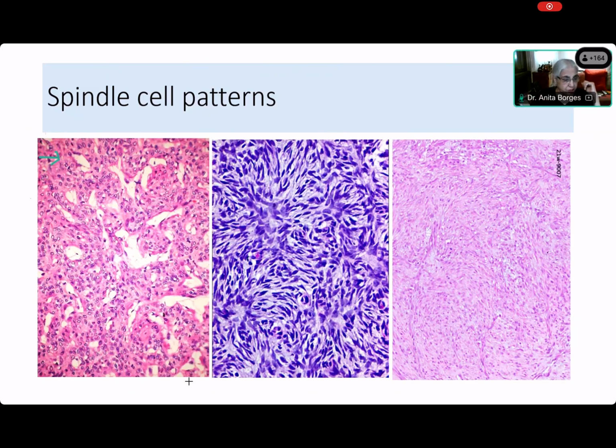No, Kedar is having difficulty. Shashank, what is this pattern that you see in this left-hand side thing? There are people in the chat box answering. All right, Chandana. Yeah, Chandana. No? Okay. Diksha. Ma'am, hemangiopericytomatous pattern. Yes, and this is not correct. Diksha, is it the spindle cell that's forming this pattern or what is forming the pattern? Ma'am, vessels are branching in a staghorn-like manner.